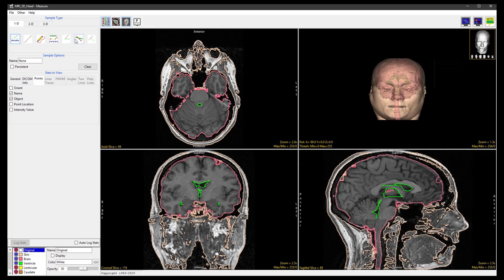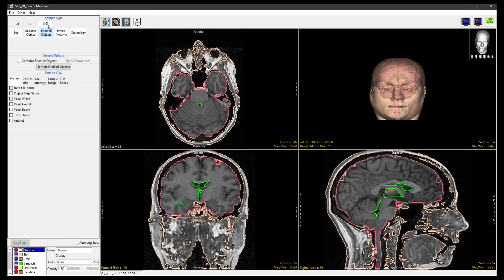Now, select the 3D sample type. In the Stats to view area, check the required measurements to be sampled, and also check the histogram checkbox.